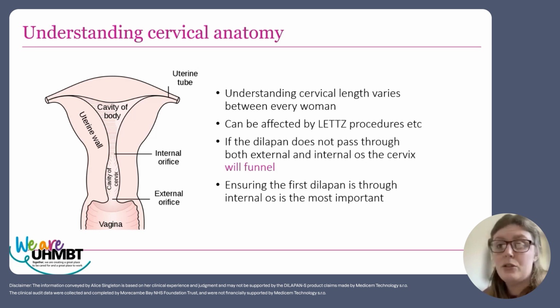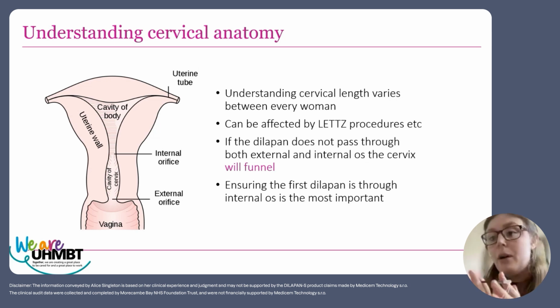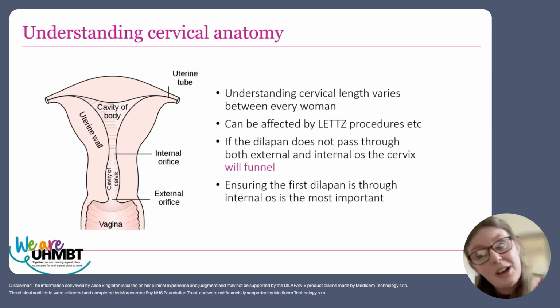If the Dilapan doesn't pass through both the external and internal os of the cervix, then the cervix will funnel essentially. And it's about ensuring that first Dilapan stick, when it goes through, is through that internal os and making sure it's definitely through, because otherwise you are going to end up with one opening, your external os, and it dilated, and your internal os is going to remain shut, which is going to be an issue because you can't ARM if your internal os is shut.